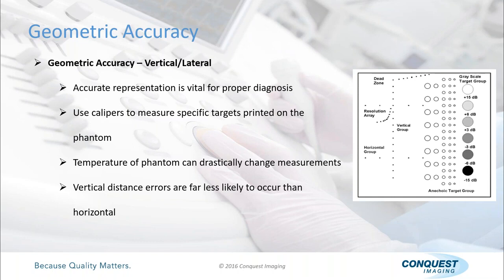And on the Phantom, specifically these two right here and these two right here are defined as 2 centimeters. Now, the one thing I find funny, they've corrected it supposedly, but these two objects also look like they're 2 centimeters. And it kind of makes sense that it would go 2, 2, 2, and 2, but it doesn't. It doesn't work like that. If you measure from this one to that one, you might get like 2.25, 2.21. It's much higher than you'll get between these two. So keep it in mind. It's defined as only these two.